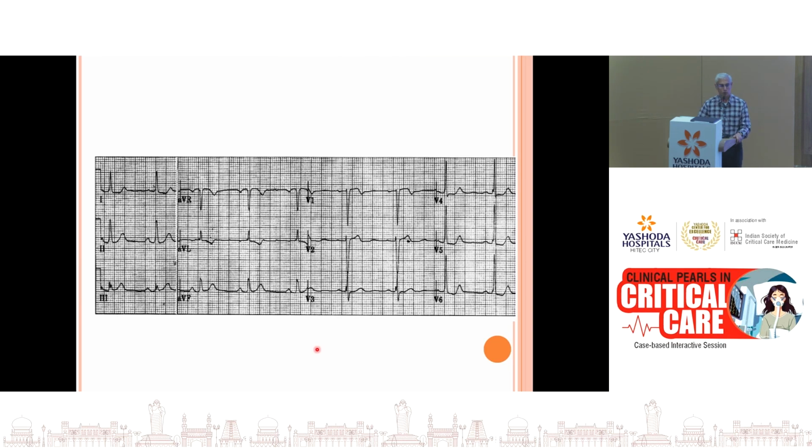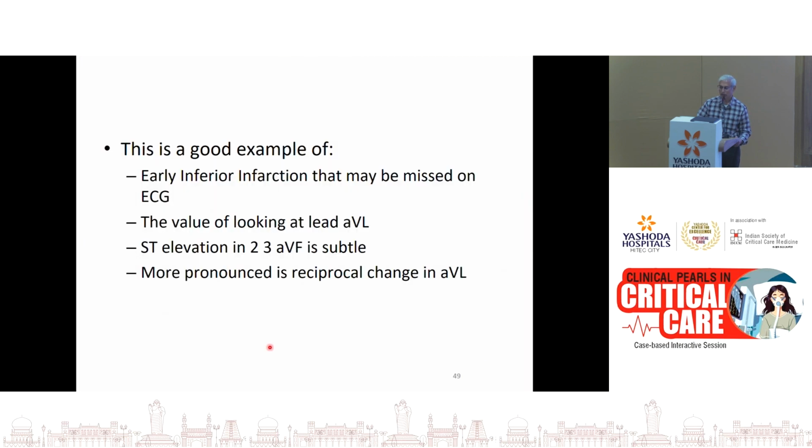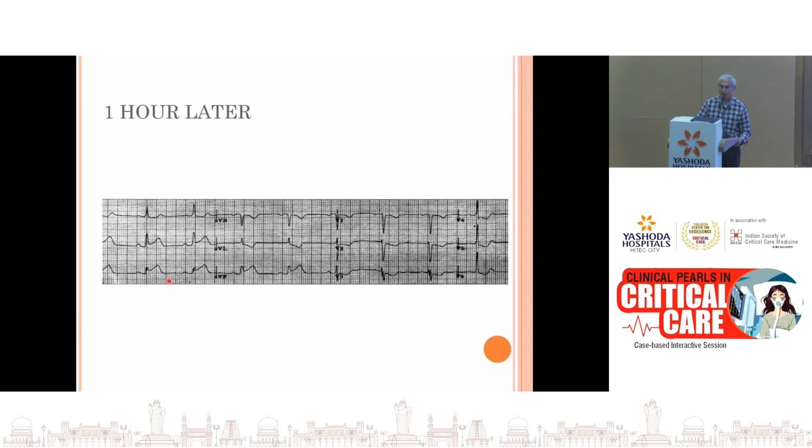Here is the value of looking at the AVL. What you are actually looking at is the reciprocal change in the AVL. There's very subtle ST elevation, which is most easily appreciated in lead 3. But what is more important and more obvious than the ST segment elevation is the reciprocal ST depression in AVL. So sometimes we miss this and we keep waiting for the patient, and an hour later things become more obvious, the ST segment elevation becomes more obvious. So what is important is for us to be sensitive to the fact that the early signs of an infarction can be subtle and often be missed.